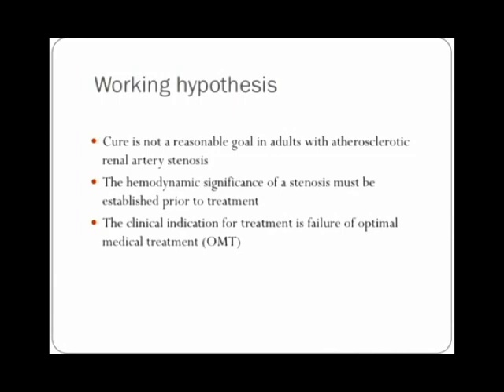And there are a lot of articles out there that I think are fabulous and tell you how to do it and how to do it the best way. And I personally prefer to use a 014 pressure wire for my measurements. It has very little effect on the stenosis. It's very difficult to measure anything without altering it. And so if you're putting a catheter across the stenosis and trying to measure it, if you're not measuring simultaneously, if you're pulling the catheter back and measuring a pressure gradient across it, there are all kinds of errors.